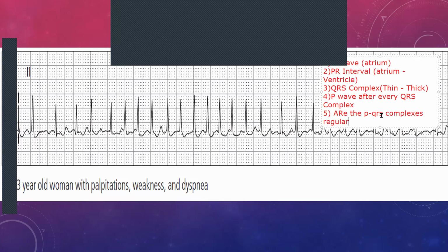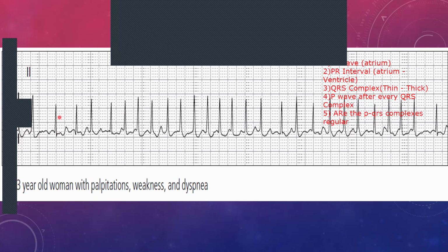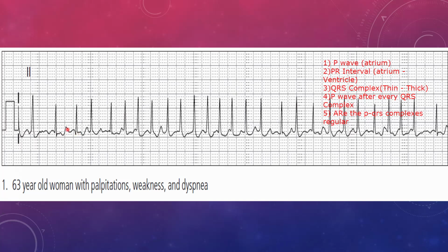So what we can do is superimpose that onto this ECG rhythm strip that we see over here. So let me just get back to that. The first thing that we're going to look at over here is if we can see P waves. And on the chat, or if any of the doctors want to jump in, they're more than welcome to. It's not a problem.